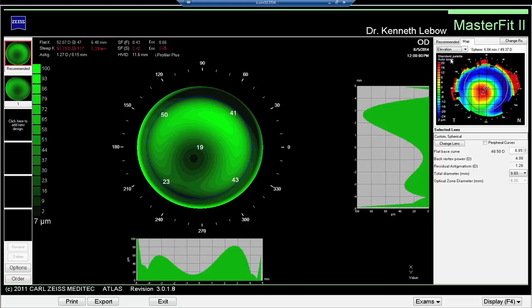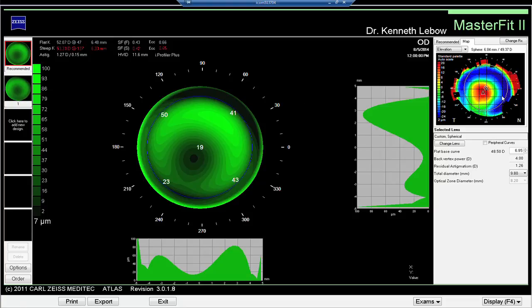An elevation map is created by determining the best-fit reference sphere to the topography data — and in essence that's almost the same as the base curve of a rigid gas permeable contact lens. Looking at this elevation map, we see a hot spot right in the center, which is the height of the keratoconus above the reference sphere. That correlates very nicely with the area of very, very thin fluorescein under the contact lens.